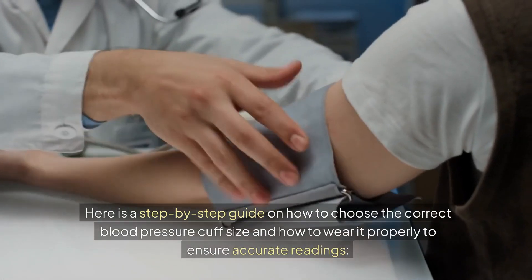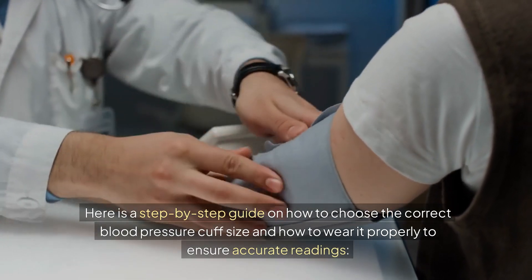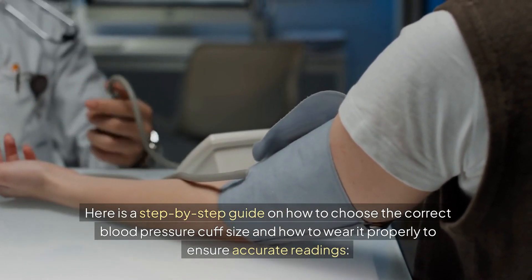Here is a step-by-step guide on how to choose the correct blood pressure cuff size and how to wear it properly to ensure accurate readings.